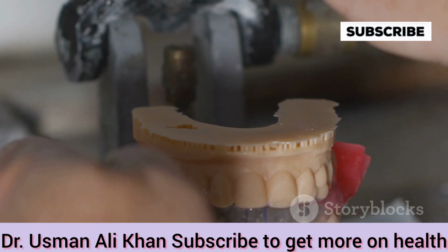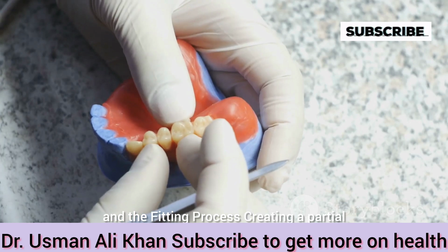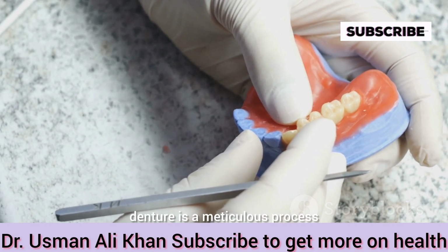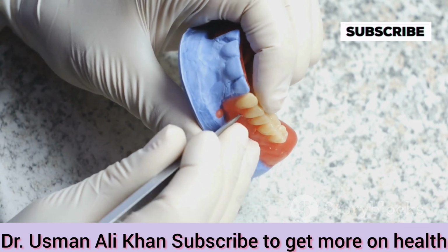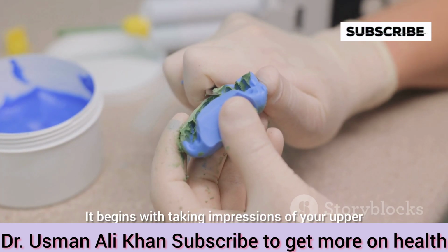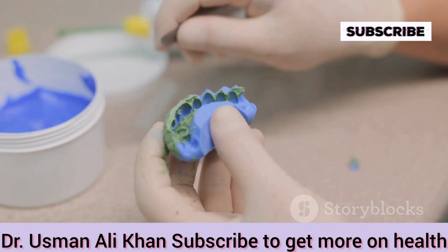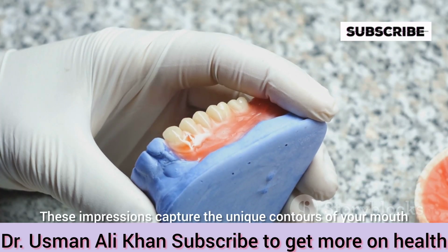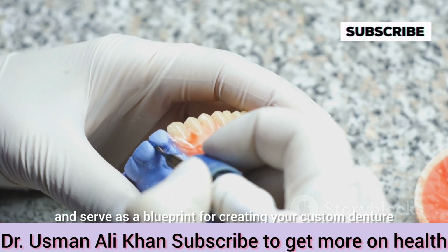Section 5. Crafting your smile, materials and the fitting process. Creating a partial denture is a meticulous process that involves several steps to ensure a comfortable and natural-looking result. It begins with taking impressions of your upper and lower jaws, using a putty-like material. These impressions capture the unique contours of your mouth and serve as a blueprint for creating your custom denture.